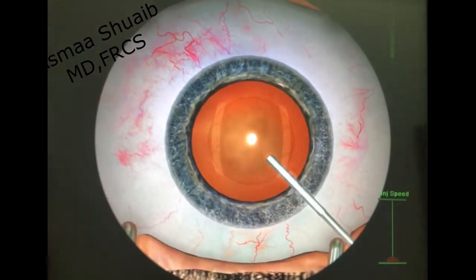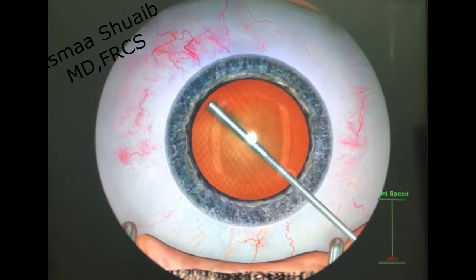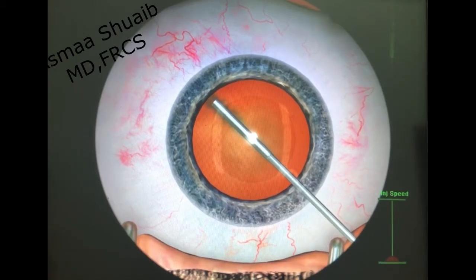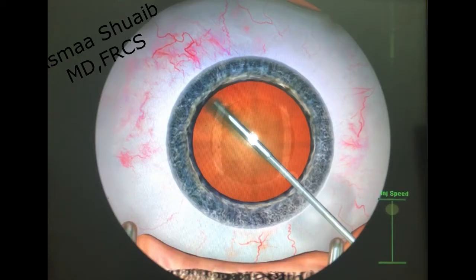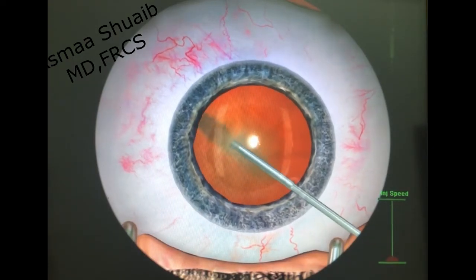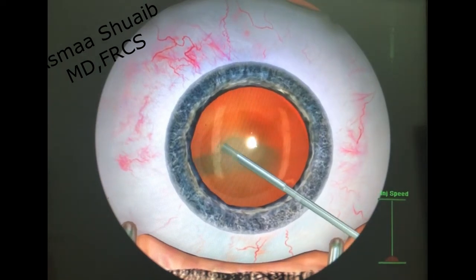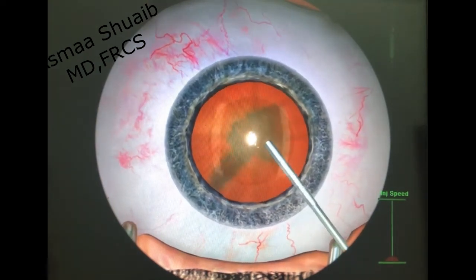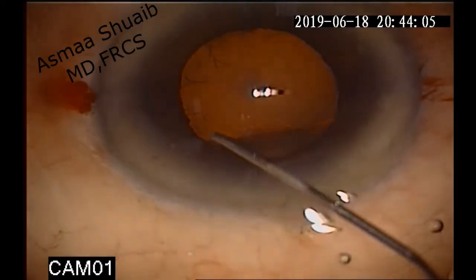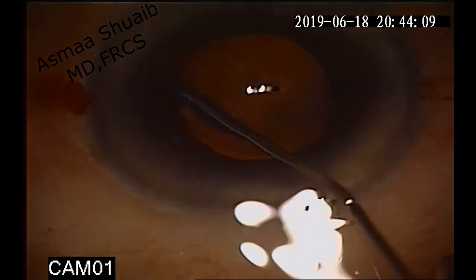Let's see this simulation for the maneuver. A cannula is inserted between the lens capsule and the lens cortex, and then the fluid is injected until a complete wave is seen. After that, you can rotate the nucleus to make sure that the process is complete. Let's watch that again and notice the posterior wave of the fluid.